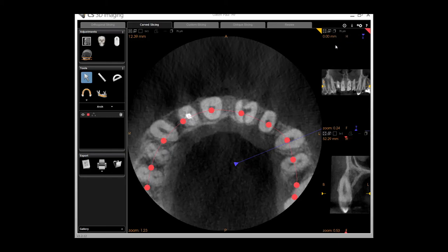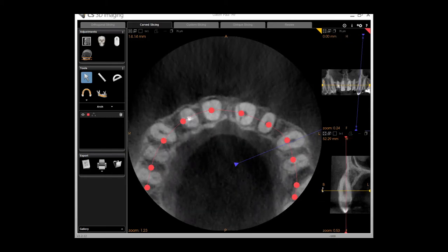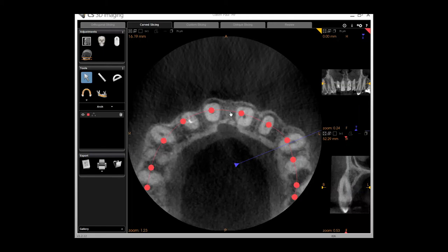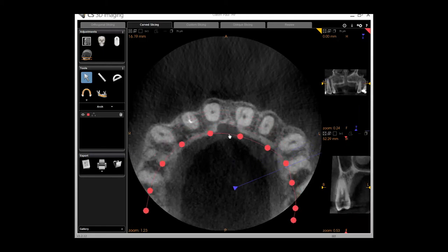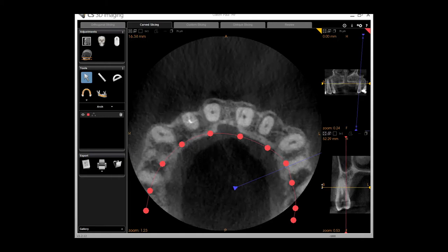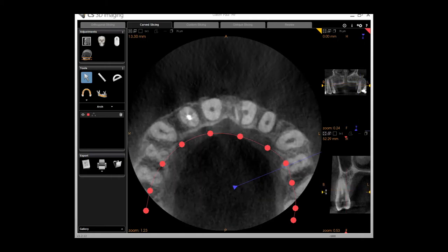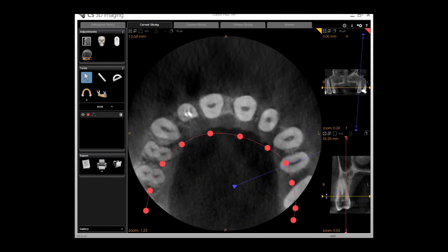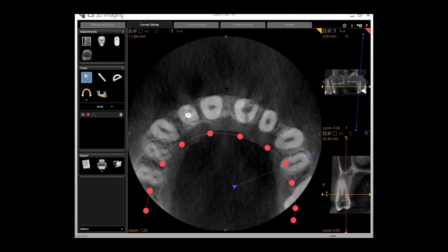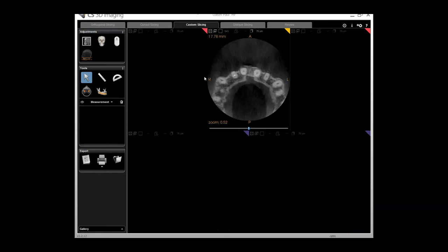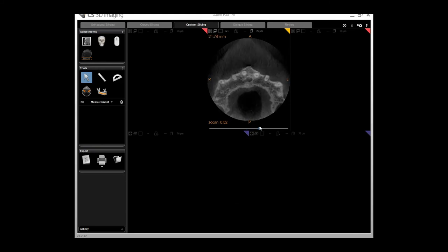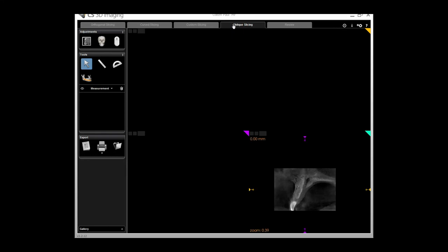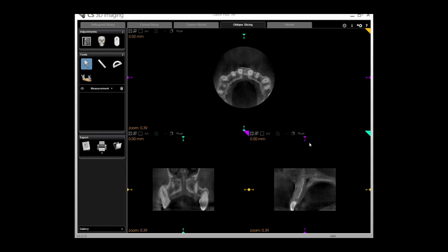To look through the fractured teeth vertically, I can take the slice to the thinnest level and tab up and down. I can then move the red arch line out of the way, which will change the other boxes but not the box I am looking at — so uninterrupted I can look through to see that fracture in the upper central incisor become clearly visible. Diagnostically it is absolutely fantastic. When I am finished I can move the red slice line back into the same position again. There are also other custom methods of slicing the scan to look at various different aspects, and you can play with those to see which are suitable for your individual cases.